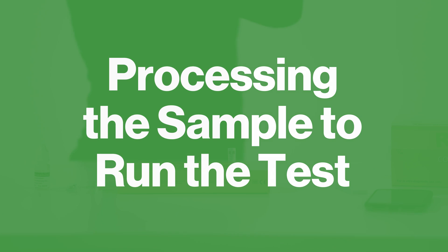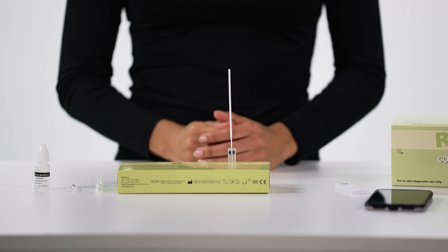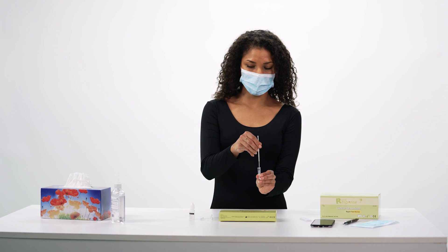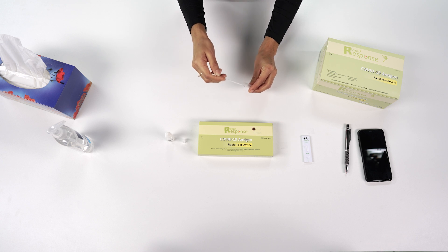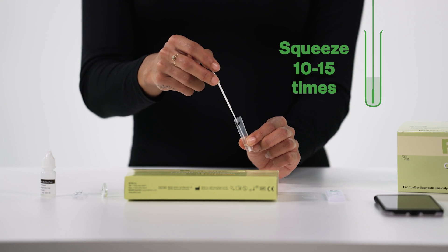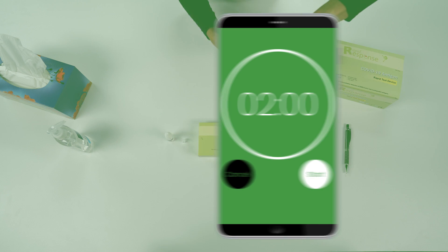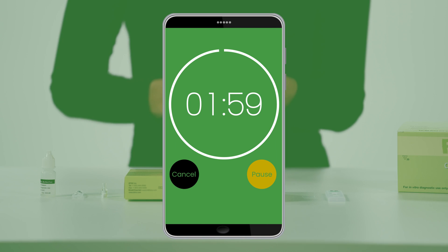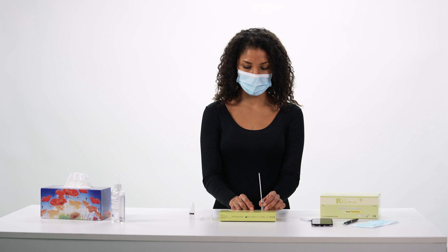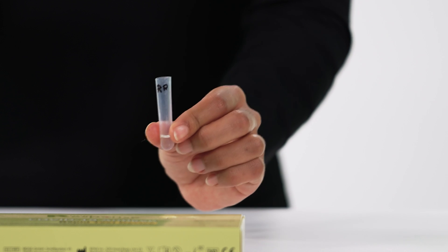Processing the sample to run the test. Now you are ready to process the sample. Begin by inserting the swab with the collected specimen into the extraction tube with the extraction buffer solution. Then pick up the tube with the swab in it. Swirl the swab, mixing it well. Squeeze the swab 10 to 15 times by compressing the walls of the tube against the swab. Place the swab and test tube back into the tube stand. Set a timer and wait two minutes before continuing. After the two minutes are up, pick up the extraction tube and remove the swab from the tube while squeezing and pressing the swab head firmly against the inner wall of the tube to release as much liquid as possible from the swab.